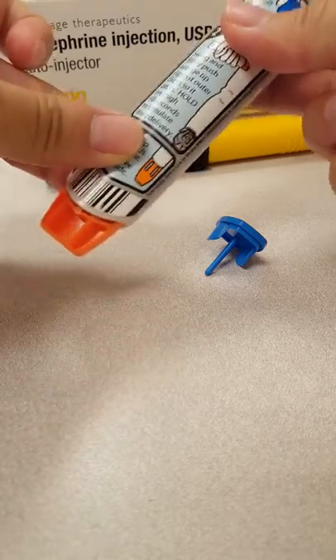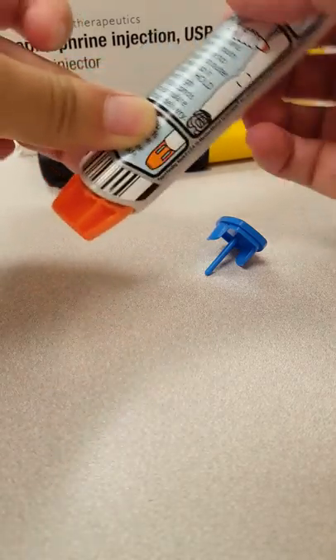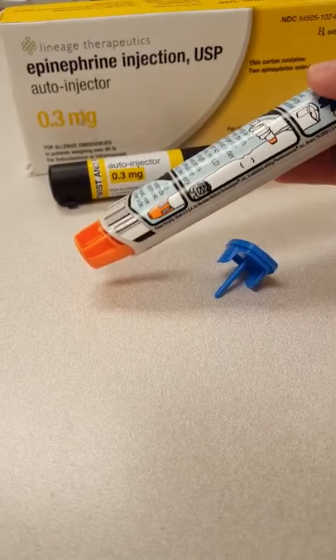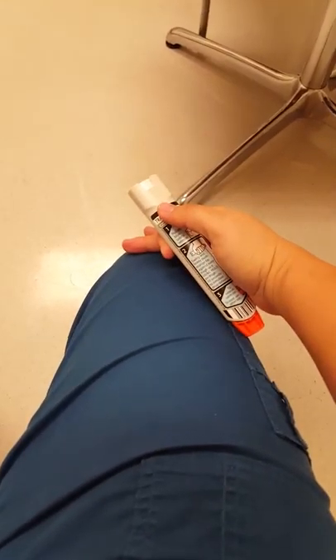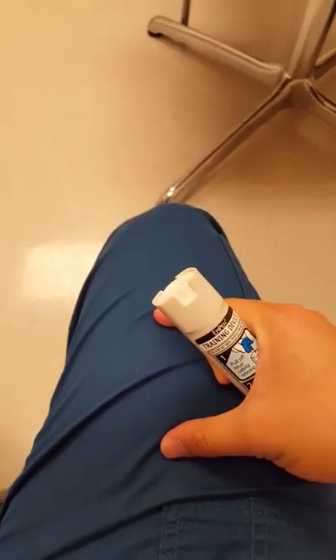Let's take a look at where you want to inject this. The EpiPen should be injected deep into the muscle. If you are injecting this for yourself, looking at your own thigh from the top view — from your knee to the top of your leg — there is the middle third.